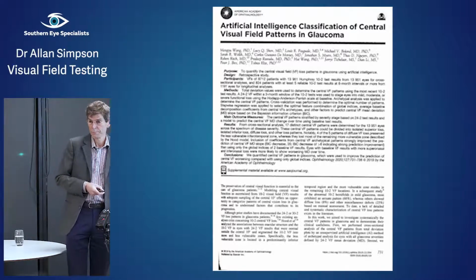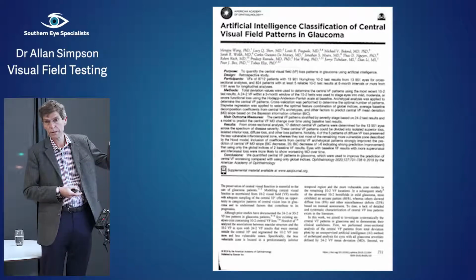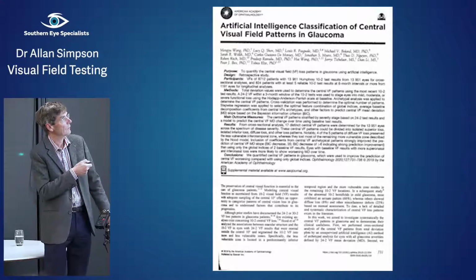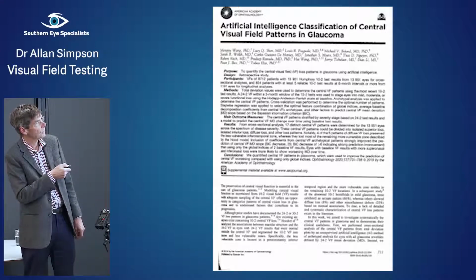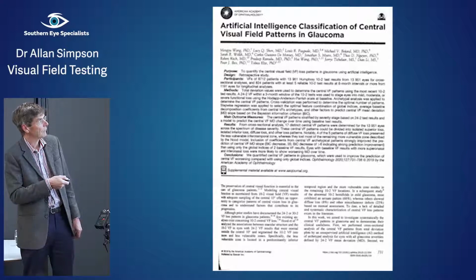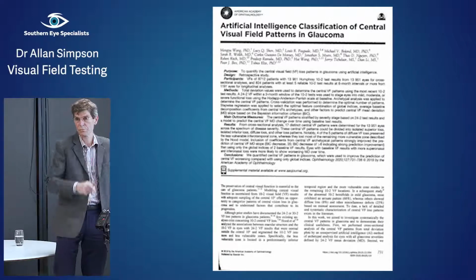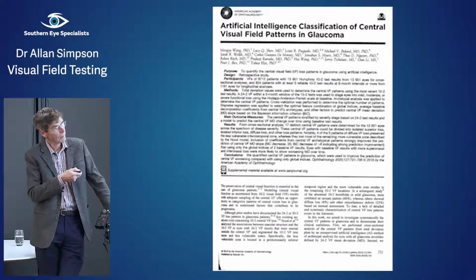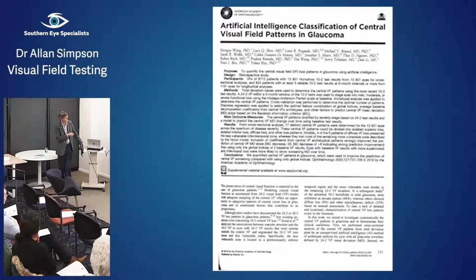They were asking this machine, black box if you like, to record all the patterns of defect found in the central visual field and to classify them. And this is what they came up with. They classified 17% as superior loss, 12% inferior loss, rather diffuse loss 20%, and a few other odds and bods down here, resolving the typical patterns they saw in this huge data set into various patterns. Then for an individual case like this one here, they could resolve out the patterns that make up that more individual test result. So for instance, in this one, the AI machine decided that this was 58% of that pattern, 35% of this pattern, and 6% of this pattern, to give you what we ended up with in this particular patient example.